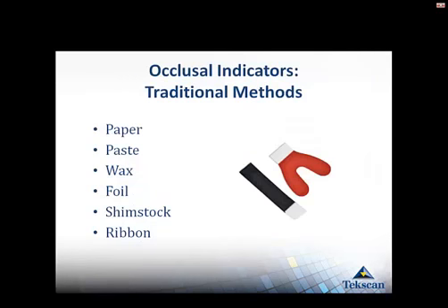Some of our traditional methods of measuring occlusion in our practice are articulating paper, paste, wax, foil, shim stock, which a lot of times is used on implants, and ribbon.